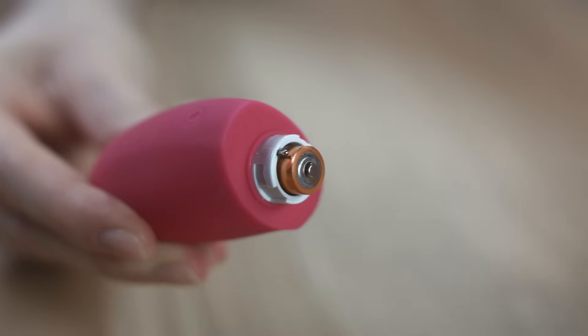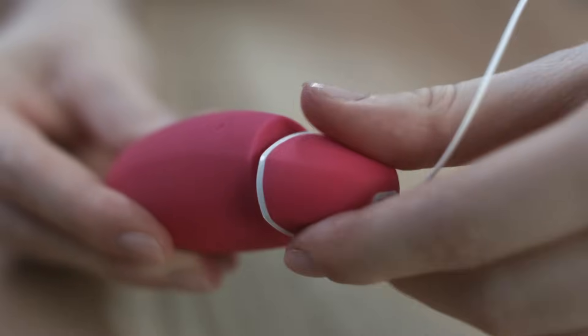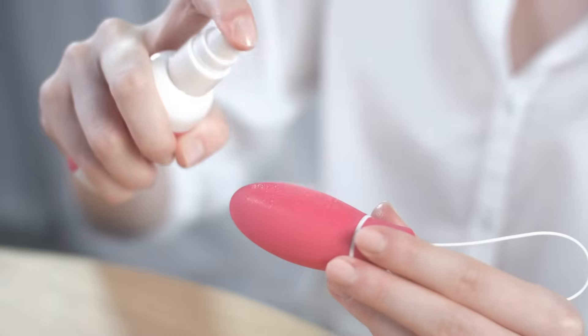Before using Kegel Smart for the first time, insert one AAA battery, which will last for about 200 workouts. Kegel Smart is completely waterproof, so you can easily clean it with soap and water or with our Intimate Accessory Cleaner.